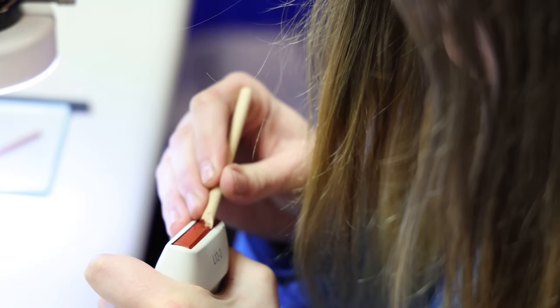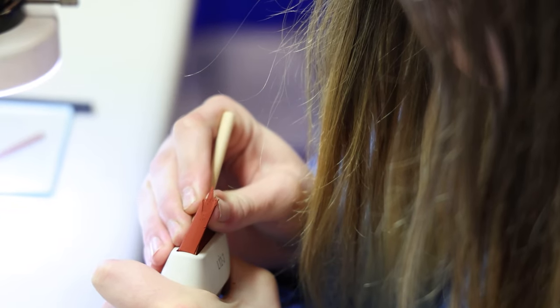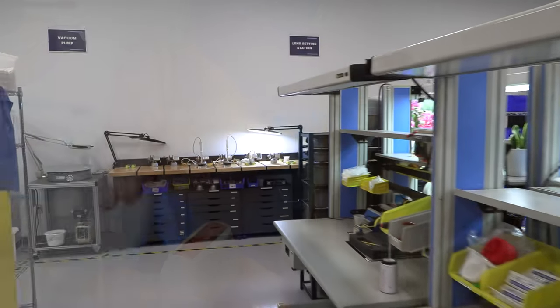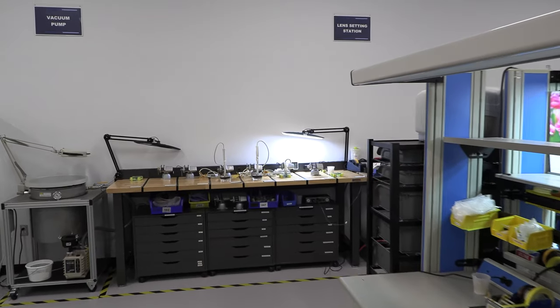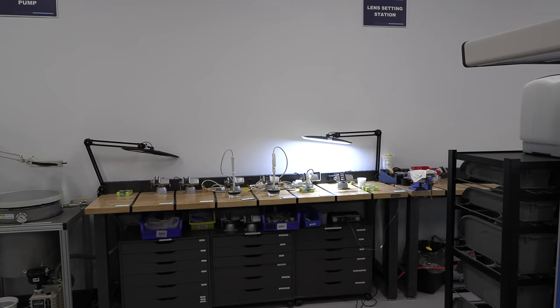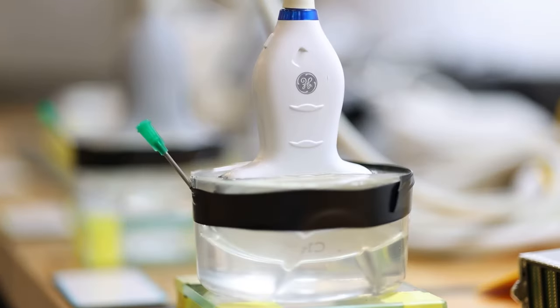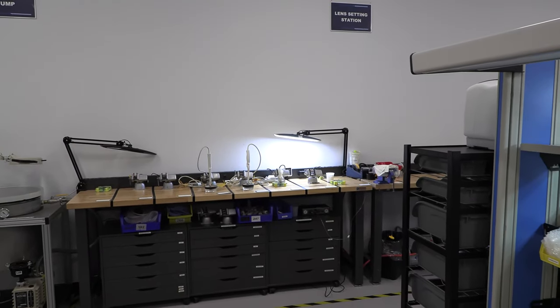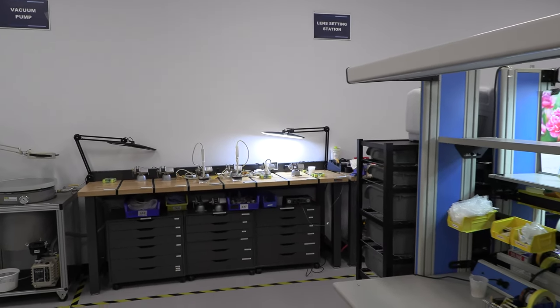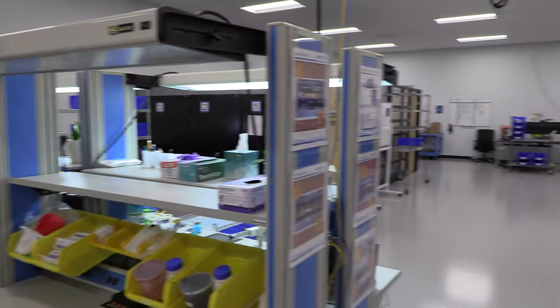Wow. So going into lens repair, you'll see we have some probes set now. Yeah, similar to our strain reliefs, we'll create molds of an OEM unit. So that's what these guys are doing? Correct. We'll create molds of OEM units, and then we'll be able to use those molds to create, again, another repeatable process. Okay. And lens is a very hot repair. You see this area is always, we're batching quite a few different things going on over here.